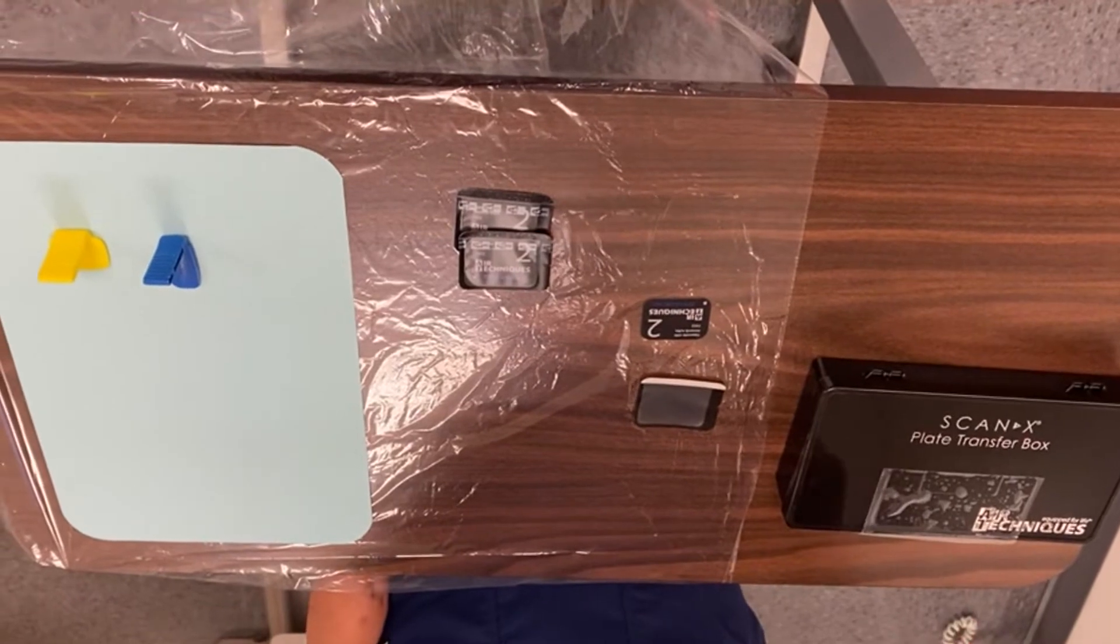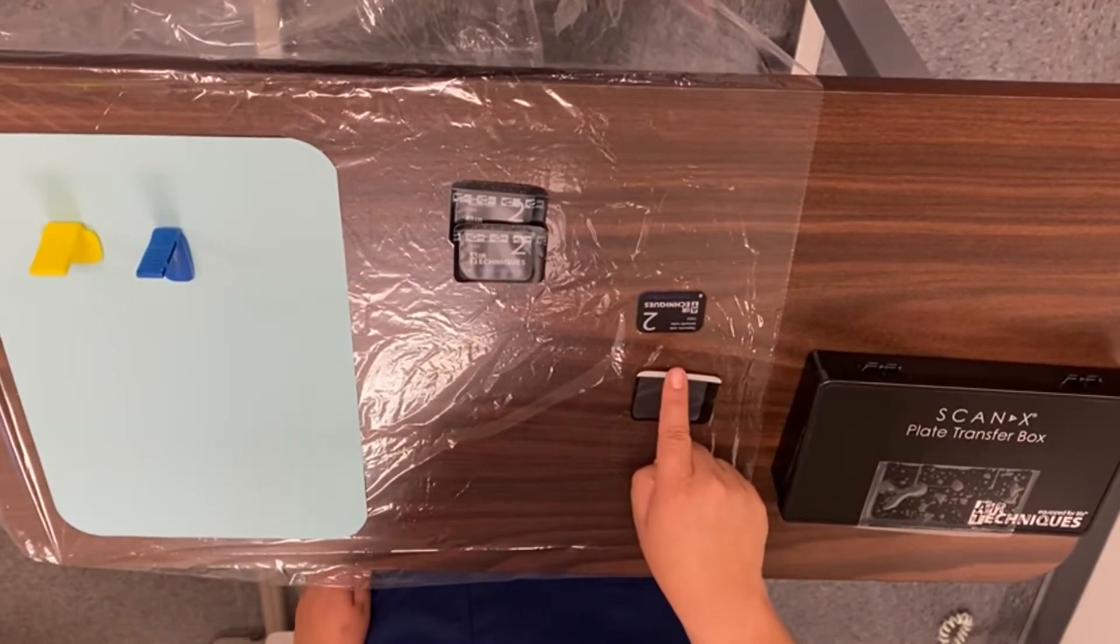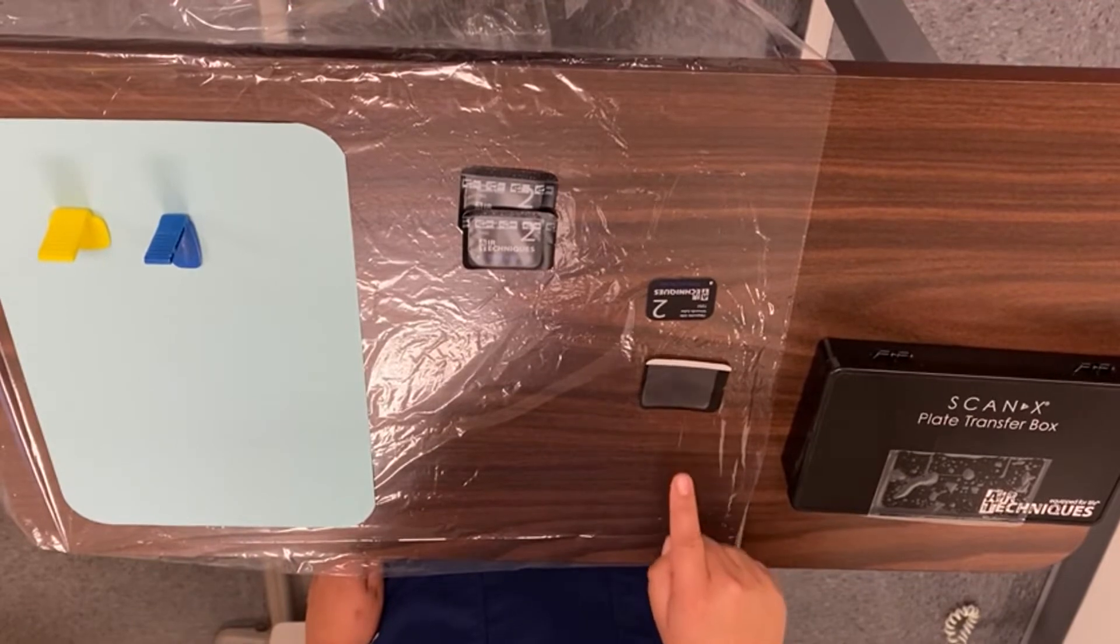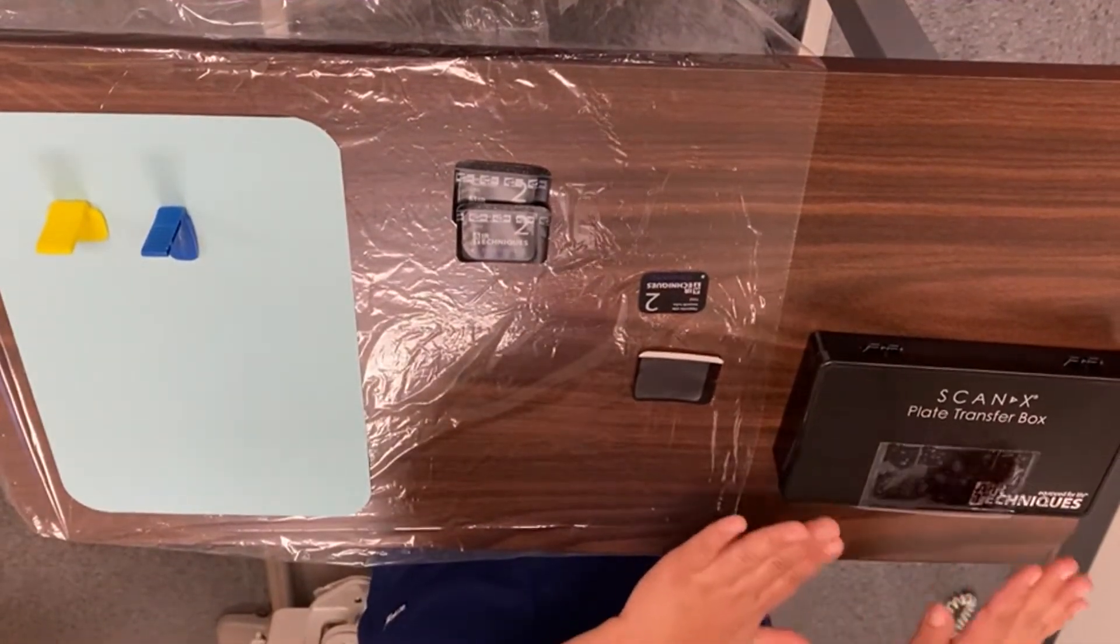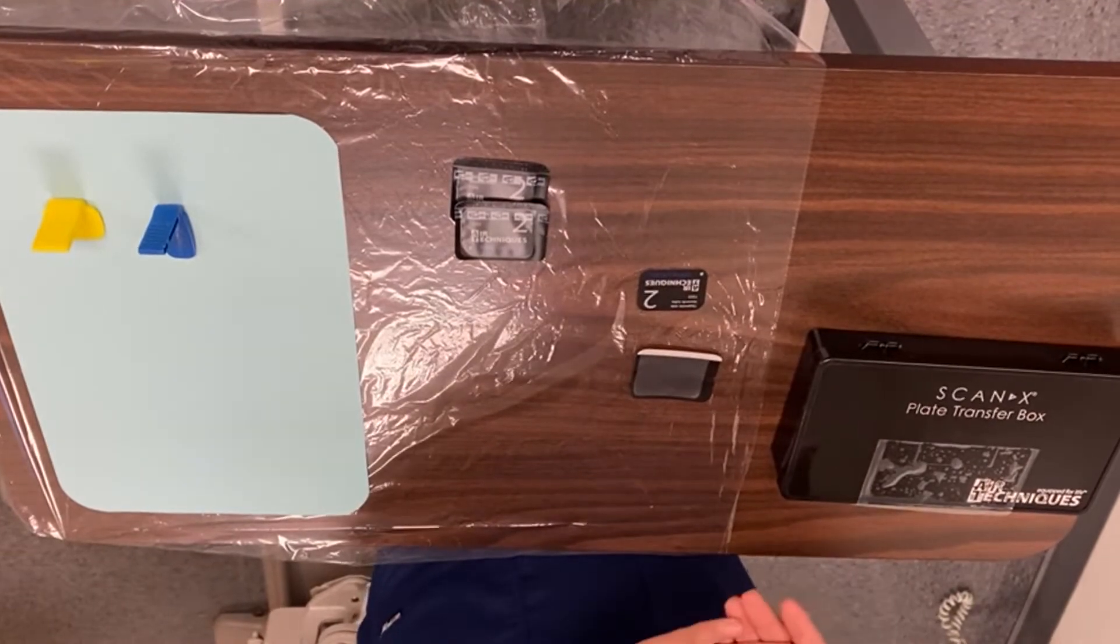Aside from that, we'll need the phosphor plates that will go into the phosphor plate sleeves, and from there they will go into the box to be protected from light transmission since they are light-sensitive to avoid any errors in the x-rays.